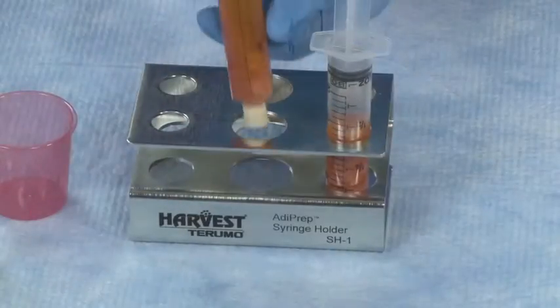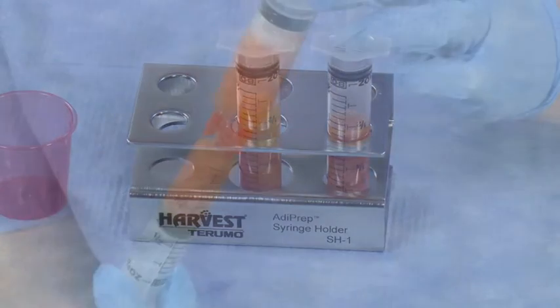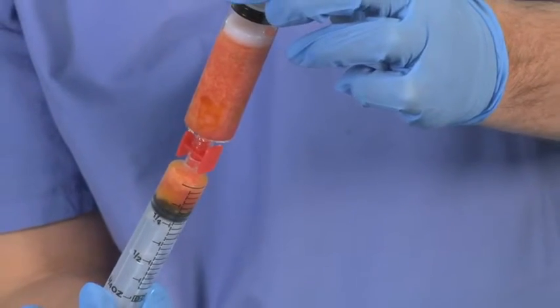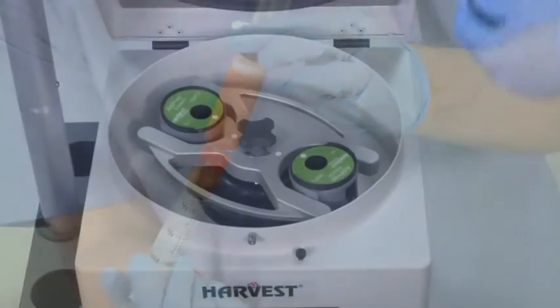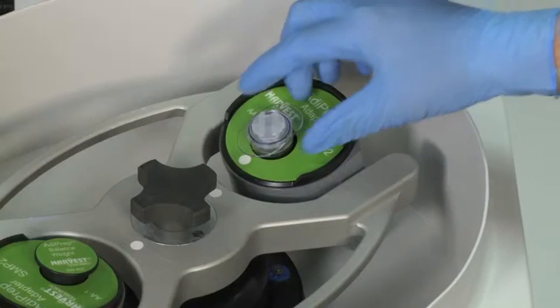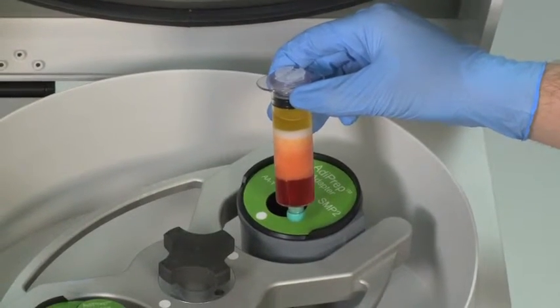In less than 10 minutes, the Adiprep system generates concentrated adipose tissue from a sample of lipoaspirate while removing contaminants such as inflammatory oils, lipids, and infranatant fluid. The resulting purified adipose concentrate can then be utilized for clinical lipografting procedures such as facial contouring.